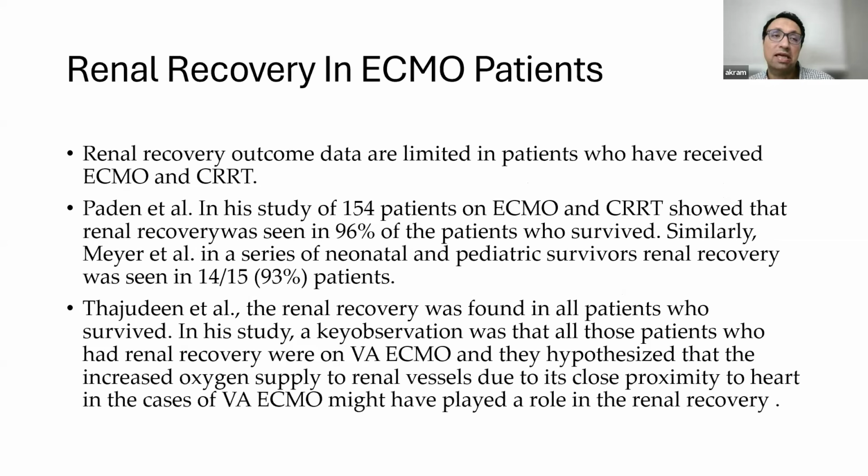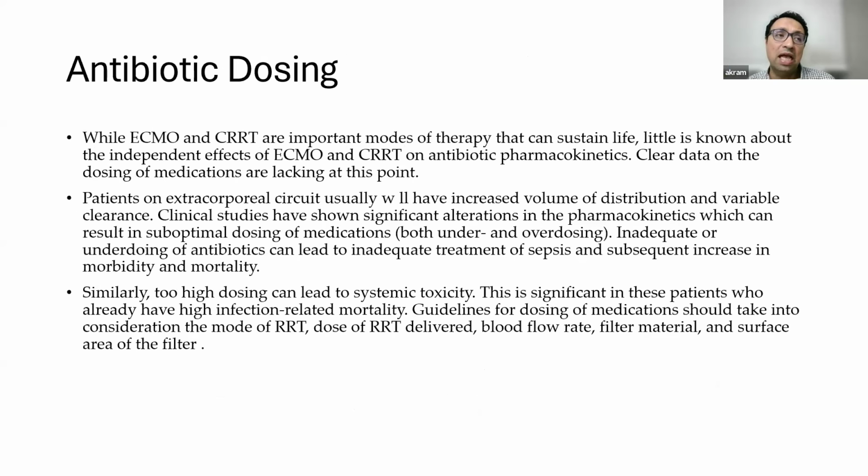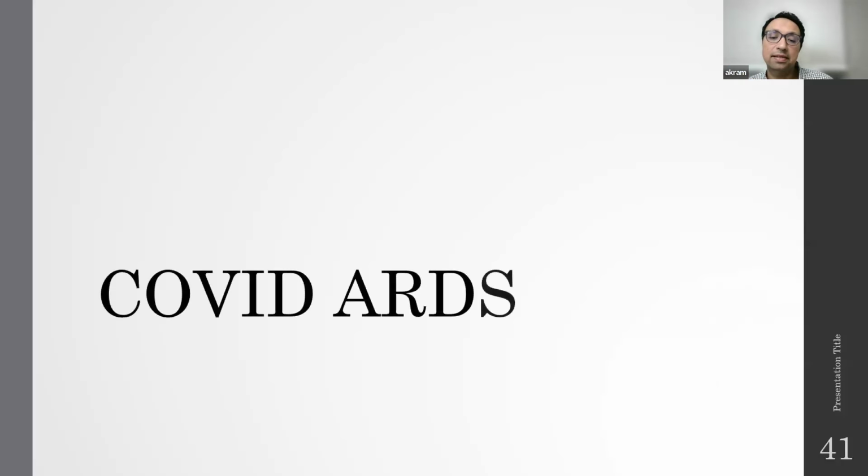However, when these patients recover, the kidneys recover completely in most patients, above 90% in different studies, as mentioned. The CRRT incorporation also helps us to maintain nutrition and to maintain full doses of antibiotics, which are usually needed in septic patients on ECMO. And this is one of the advantages of using CRRT instead of intermittent hemodialysis.